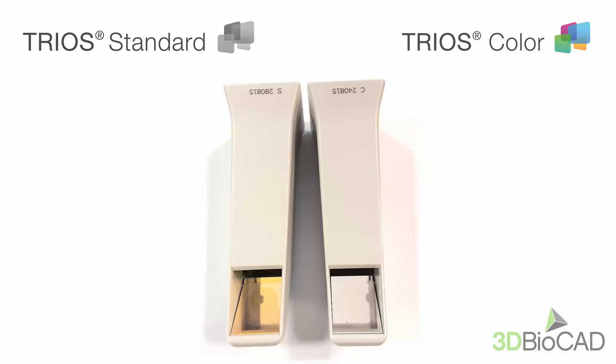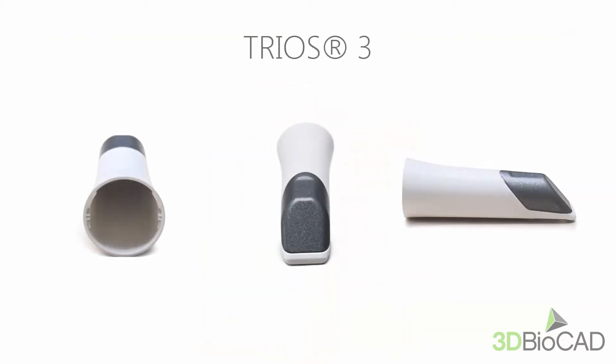Our first and second generation scanners had visibly the same scanner tips by design. The difference was in the mirrors. TRIOS standard scans in black and white, whilst TRIOS color can scan with real colors. The TRIOS 3 tip has a smaller design and also includes interchangeable mirrors.